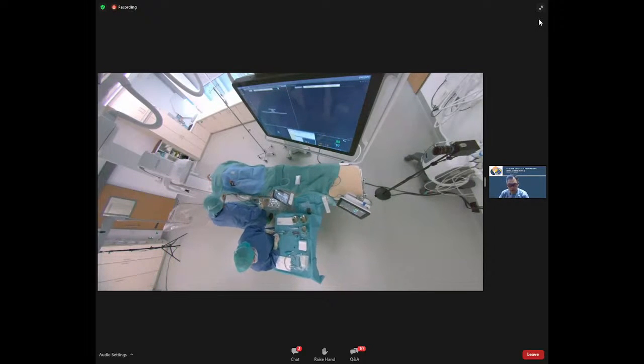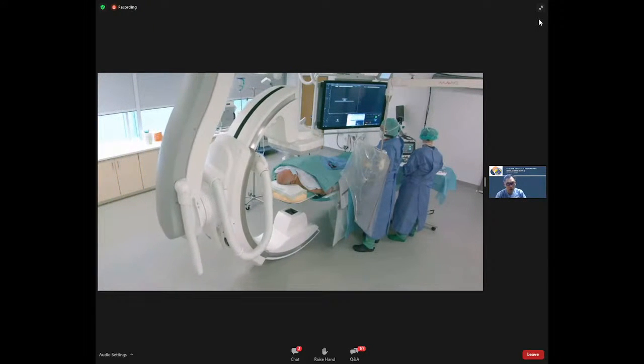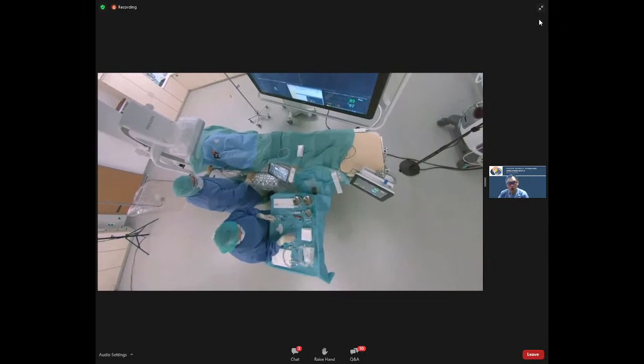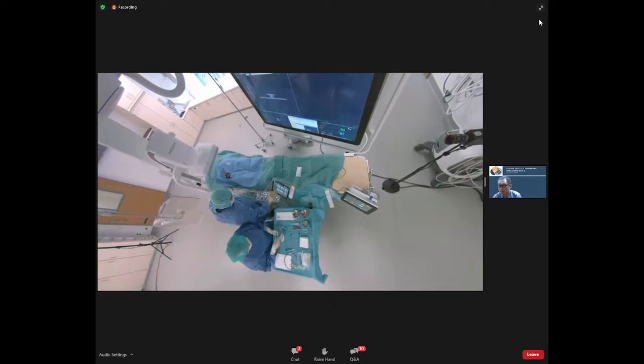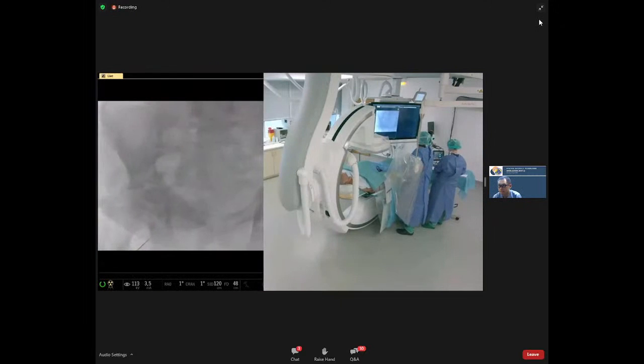brought into working position. Here you can see the C-arm can reach the groin in the propeller position due to the positioning of the patient as high as possible on the table. The correct protocol is selected on the touchscreen module, TSM, for the right procedure acquisition program and FlexVision monitor layout.